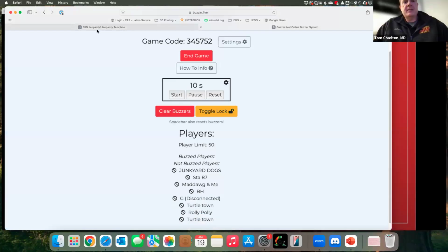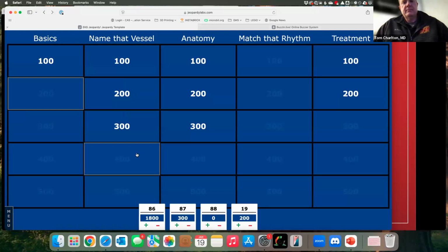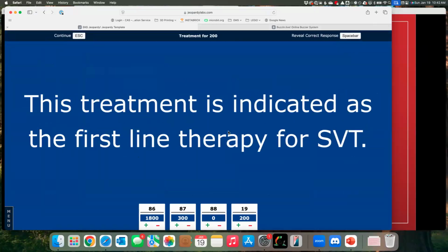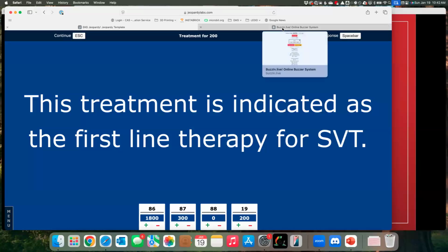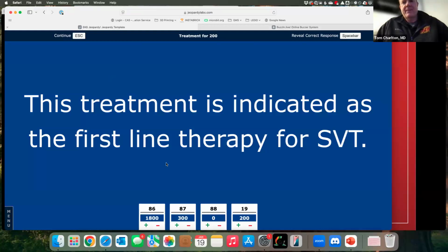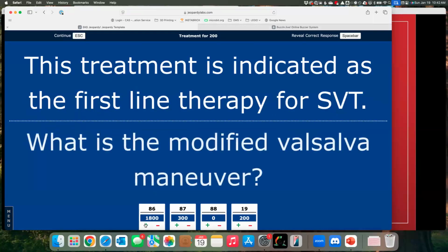All right, 86s. Treatment 200. Mad Dog and Me. What is vagal maneuvers? Yes.